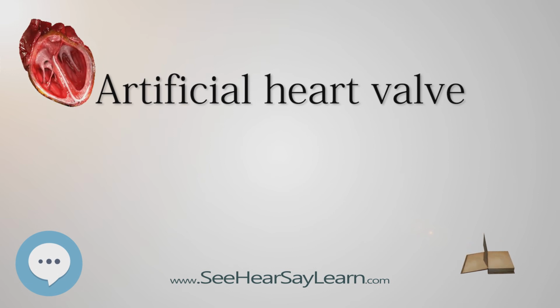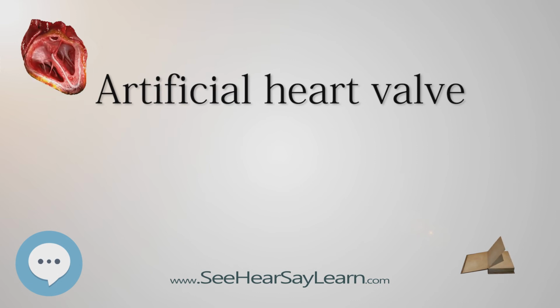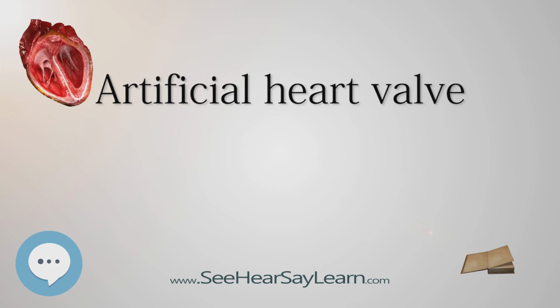Blood damage. One of the major drawbacks of mechanical heart valves is that patients with these implants require consistent anticoagulation therapy. Clots formed by red blood cell, RBC, and platelet damage can block up blood vessels and lead to very serious consequences.